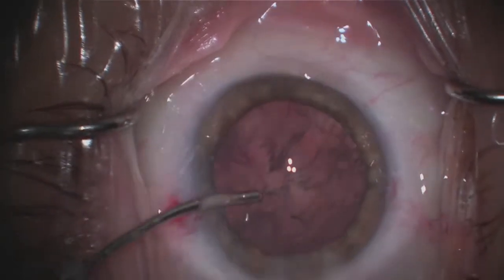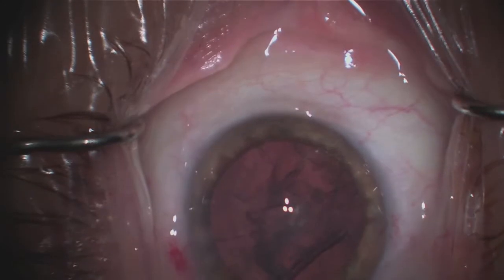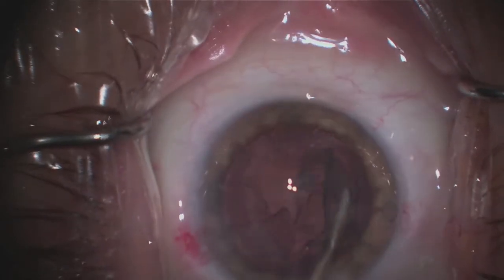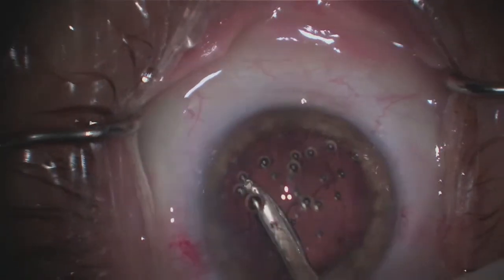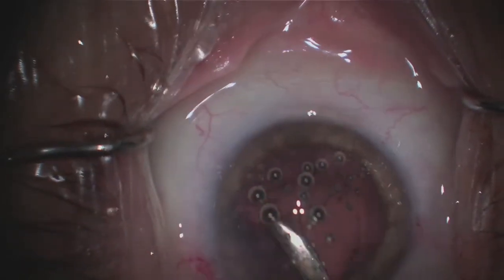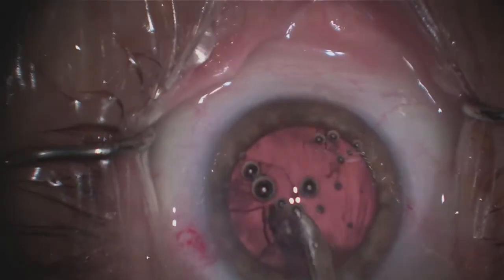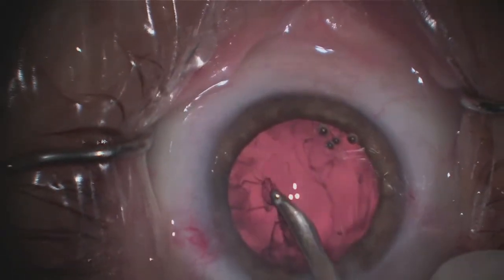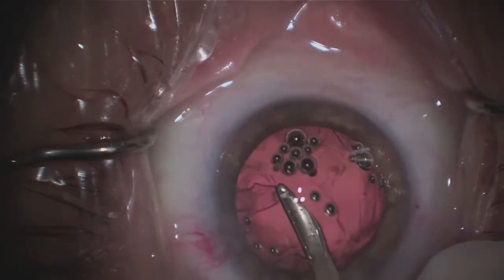At this point, the entire cataract — or at least the bulk of it — is removed. What's left is a fine membrane closest to the bag called the cortex, and this is the last step to remove the actual cortical material. I'm going in with another instrument to remove the cortex. Sometimes this is the most tedious step, because you're trying to remove this really fine membrane from the actual capsule.